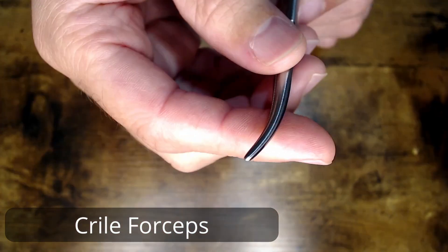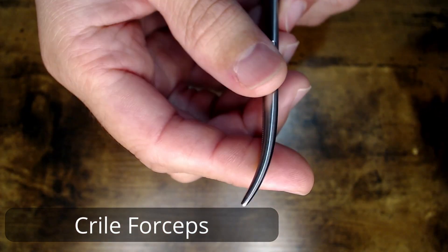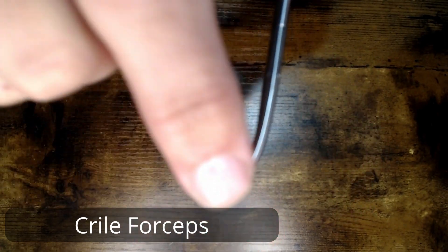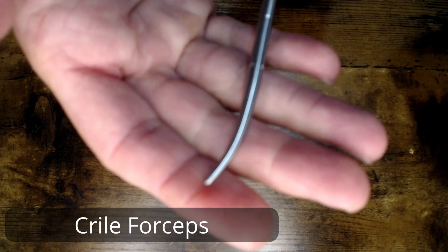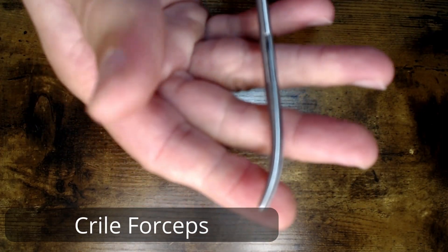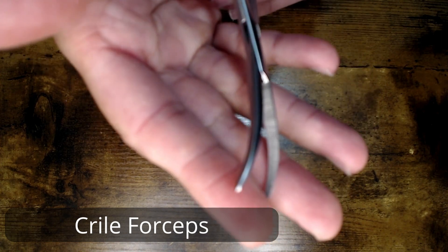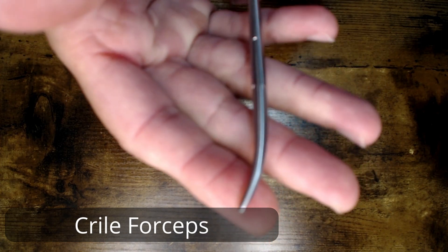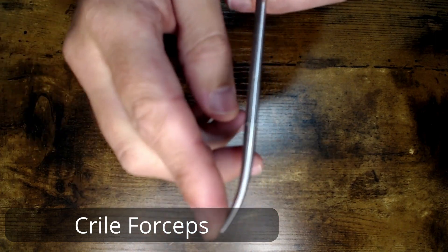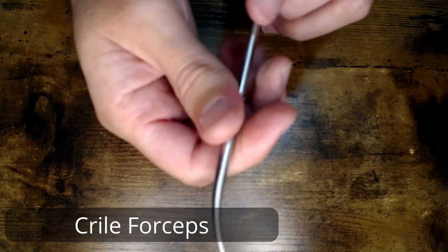Just keep in mind that it is still aligned — a good alignment check. Looking at it from both sides, top down, if you hold it perpendicular to yourself, then just open those jaws, close the jaws, and make sure that that alignment is still straight on for both jaws on both sides.